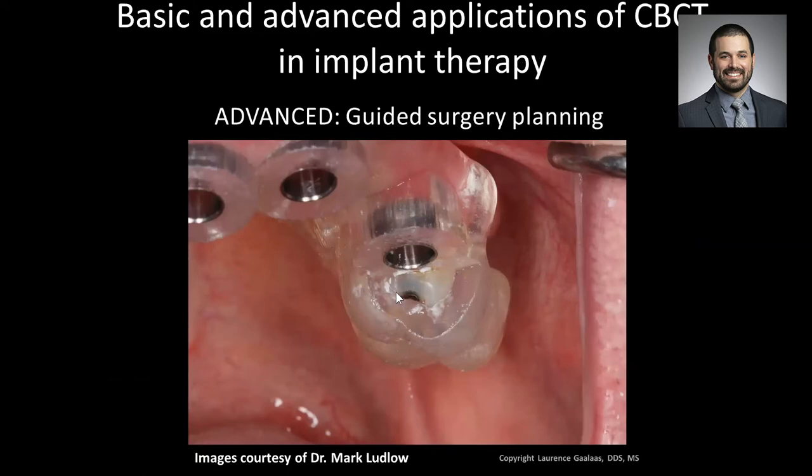And when you get to this surgery stage and you have the guide, you need to make sure it seats correctly and is exactly set up the way you planned or intended it. Because if you don't do that, then where you prepare your osteotomies through these little guide holes could be any which direction.